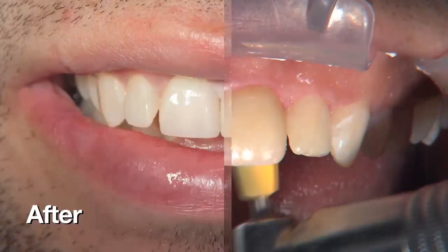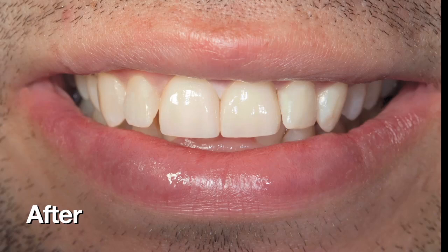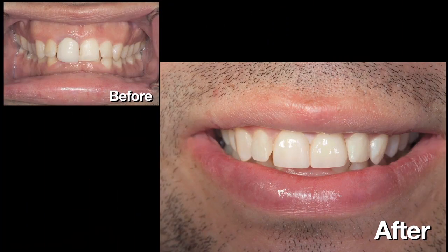Sometimes my technician at the laboratory will put a little finger on a no-prep veneer that wraps over the incisal edge, so it'll slide down and stop when that finger hits — but then you have to take a burr and cut off that little finger afterwards. Here's the patient in the after photos, taken the same day. We still have a little dehydration there, but looking pretty good considering those are solid zirconia. They don't look as good as natural teeth, but they're starting to look better because of the increased translucency in the material. Now I'm feeling more confident placing a Bruxer veneer on the tooth next to a Bruxer crown so the two teeth match — as long as eight and nine match, we have a chance of a nice smile.